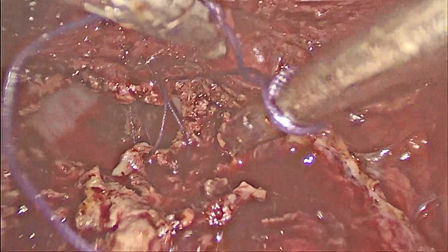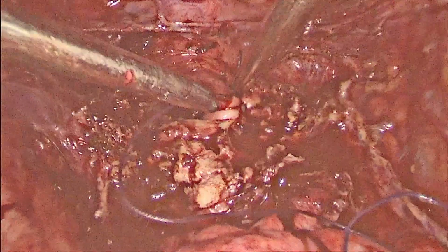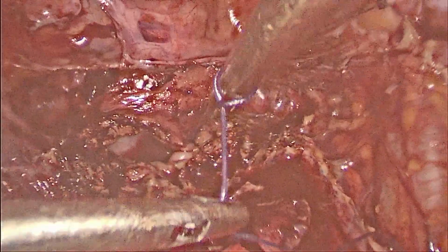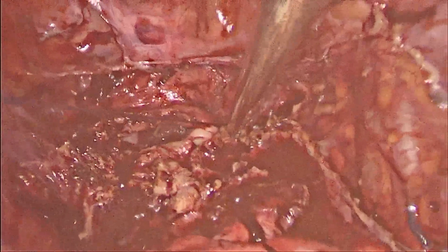Care should be taken that whenever there is an adnexal mass, every time try to identify the ureter, and only if the ureter is exposed, then tackle the infundibulopelvic ligament. If you are still finding it difficult to excise the adnexa in toto with the uterus, then very well divide the cornual pedicles, and after completion of the hysterectomy, you can go back and remove the adnexa safely, where we will have enough exposure and the dissection becomes much easier.